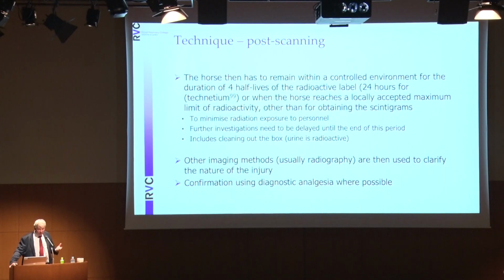Once this period is over, we then usually employ imaging methods, most frequently radiography, of course, because we're looking at bone pathology. But we may also use diagnostic analgesia where possible to confirm the site of the lameness.